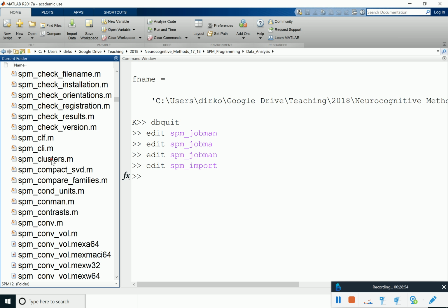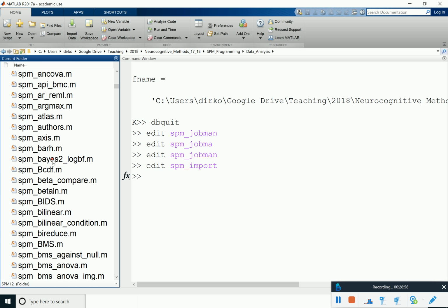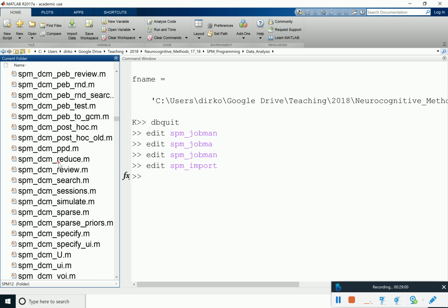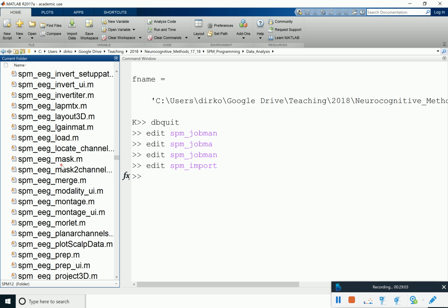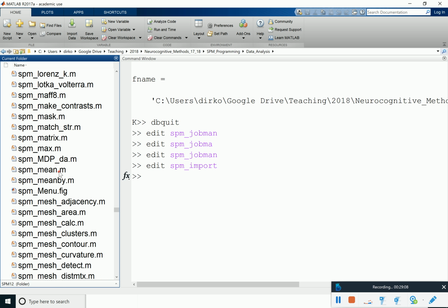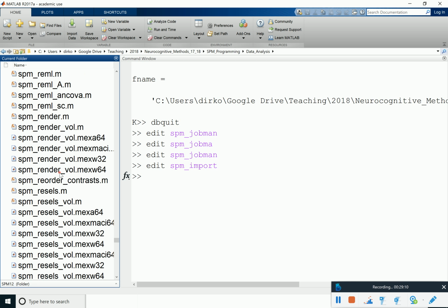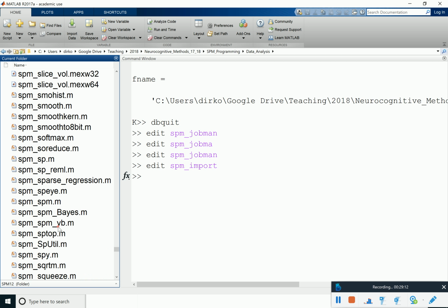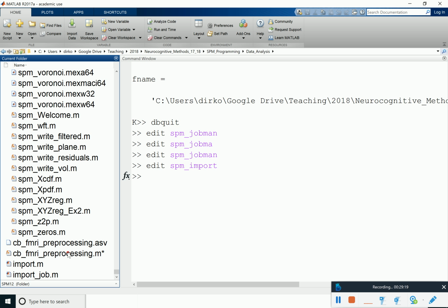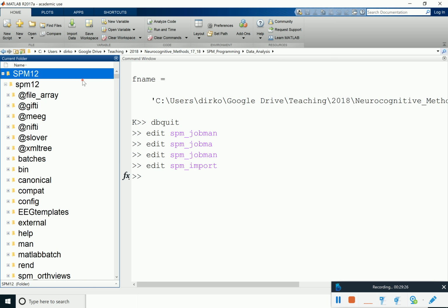It's convolve. So there's some conversion functionality. I'm not quite sure what the function is called at this point that actually does that. Maybe it can also be C code, but this Jobman always interacts with these low-level functions, which sometimes, of course, also call MATLAB low-level stuff. Any other question? You only called par files, not the rec files.